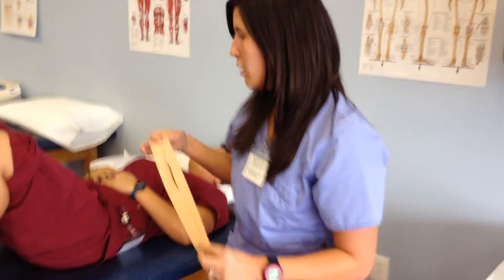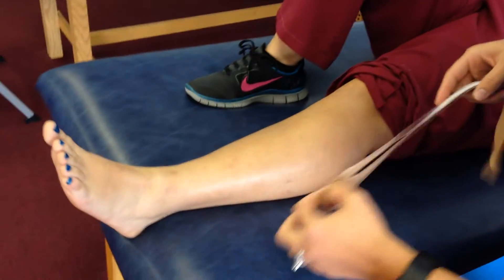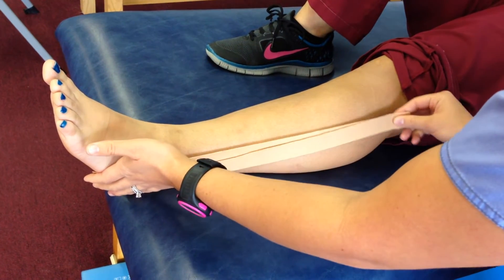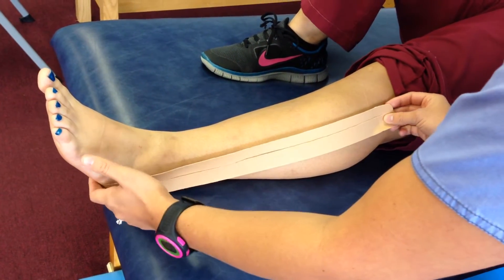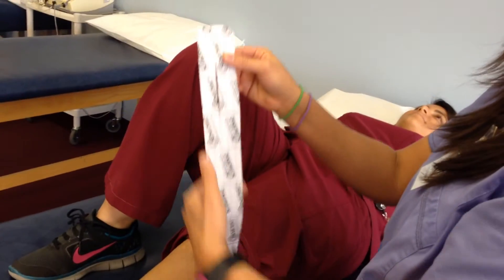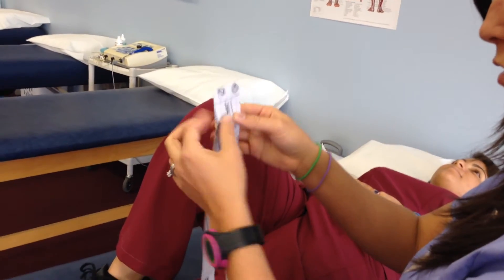You're going to get your kinesio tape. You're going to measure from the calcaneus cuboid area, the plantar aspect, and then measure up to the proximal attachment of the peroneals. You're going to leave a two-inch base at the top, and then cut a Y all the way up, leaving two inches at the top.